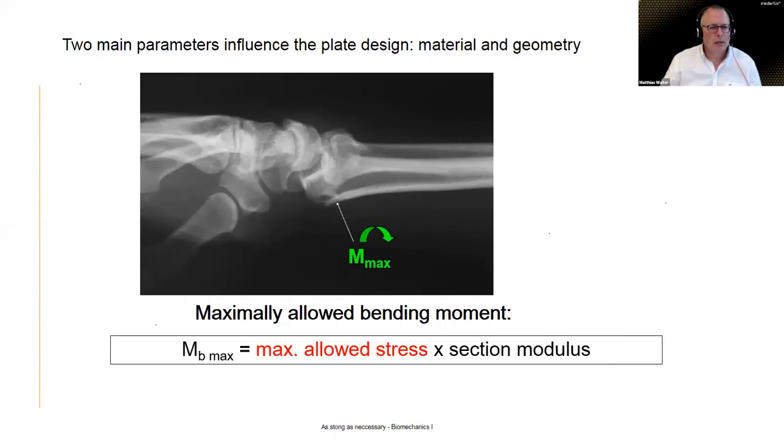Oh, there's another question from Brandon. Is titanium less likely to be irritable to a patient than other metals such as stainless steel, and why? That's a good question. Well, part of it is titanium is an inert material. So once it creates a titanium oxide layer, for whatever reason, the body cells don't seem to recognize it as a foreign material. So in actual fact, it's so tissue friendly that potentially bone cells like to grow directly or cling directly onto the titanium surface unless it is very smooth and polished, right?